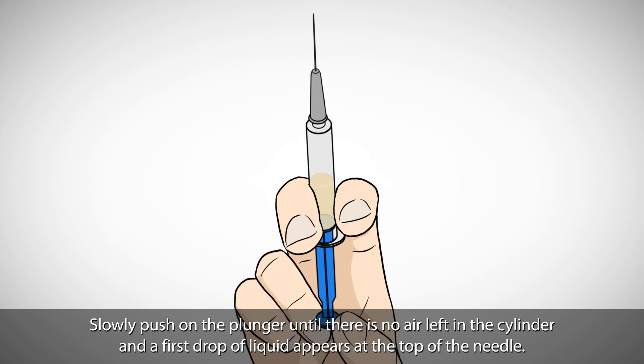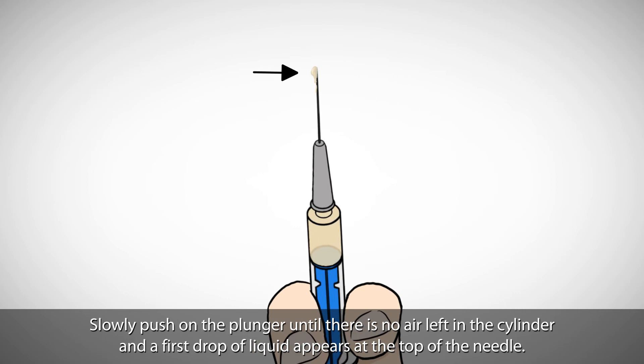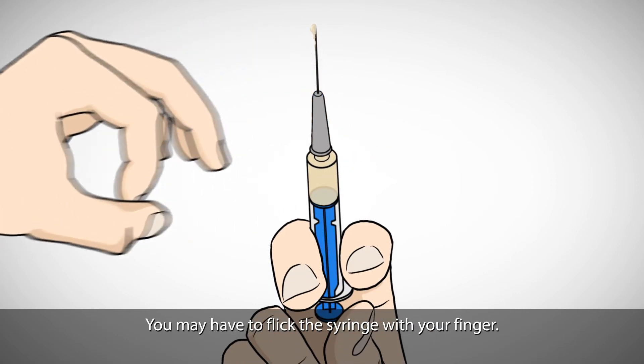Slowly push on the plunger until there is no air left in the cylinder and a first drop of liquid appears at the top of the needle. You may have to flick the syringe with your finger.